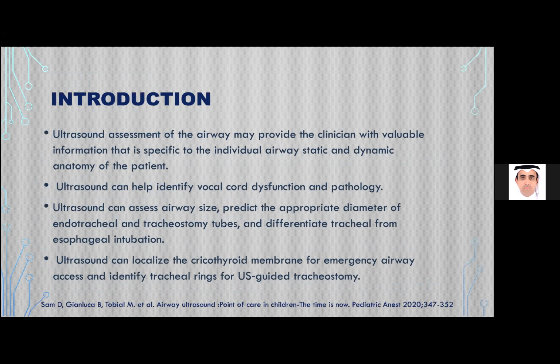You know, this is ultrasound. This is one of the important machines coming to the emergency or critical area, and we utilize this machine for different procedures and applications, especially for patients going for a difficult airway. So ultrasound is very helpful for assessment of the airway, and may provide the clinician with valuable information that is specific to the individual airway, static or dynamic, during the procedure of intubation.